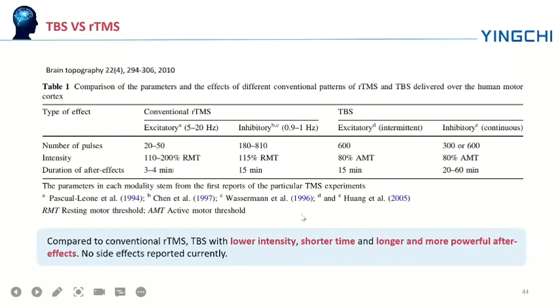So why do we say that TBS is an optimized protocol compared to rTMS? Because as you can see here, TBS has lower intensity and shorter duration, and has longer and more powerful after effects, and no side effects of TBS have been reported currently.